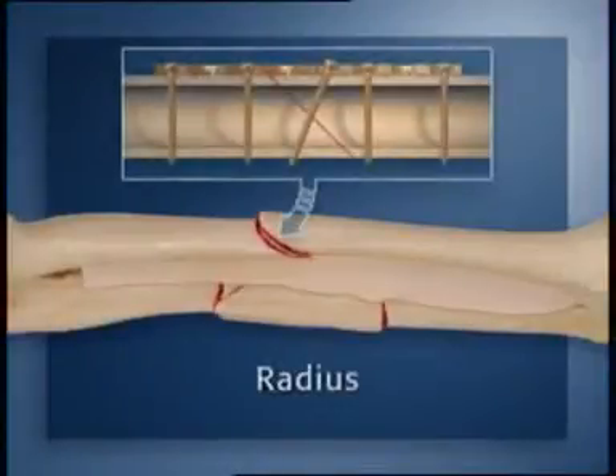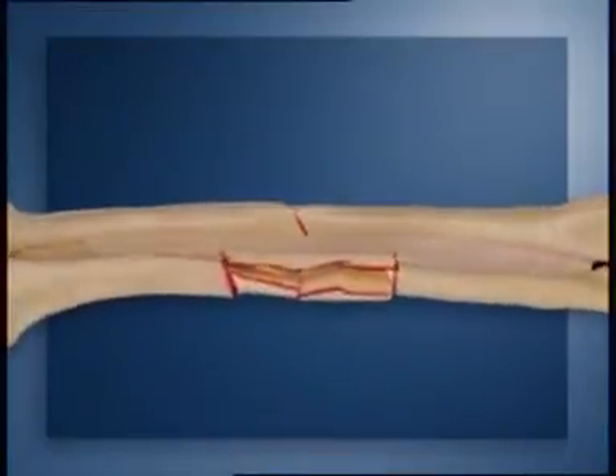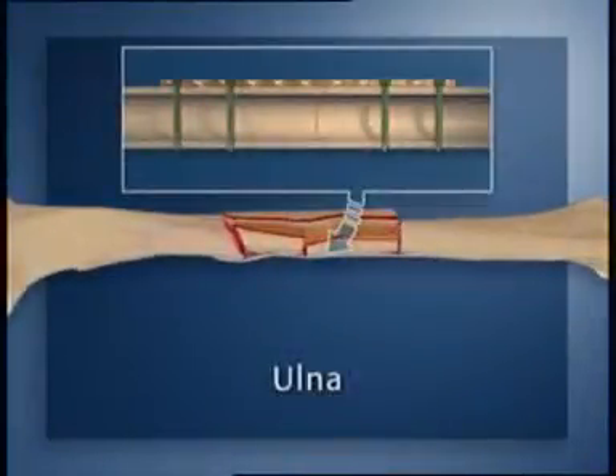The simple radius fracture is to be stabilized in the conventional way, with an 8-hole 3.5 LCP applied as a compression plate with an interfragmentary lag screw, providing absolute stability. The complex ulna fracture will be repaired with an 11-hole 3.5 LCP used as a bridging plate. The procedure follows the principles of the internal fixator and provides relative stability.